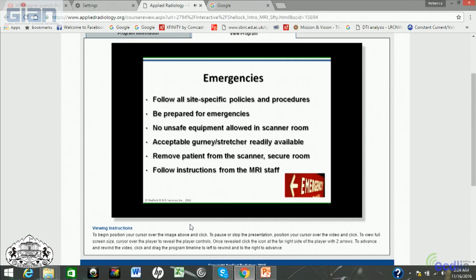Healthcare professionals who are members of the cardiopulmonary resuscitation or Code Blue team must be specially trained and prepared to conduct their activities in the MRI environment, with an emphasis on removing the patient from the room as quickly as possible so that patient management occurs at a safe distance from the scanner. For outpatient or mobile MRI facilities, it is necessary to provide prior education to outside emergency personnel such as paramedics and firefighters regarding the potential hazards associated with the MRI environment.